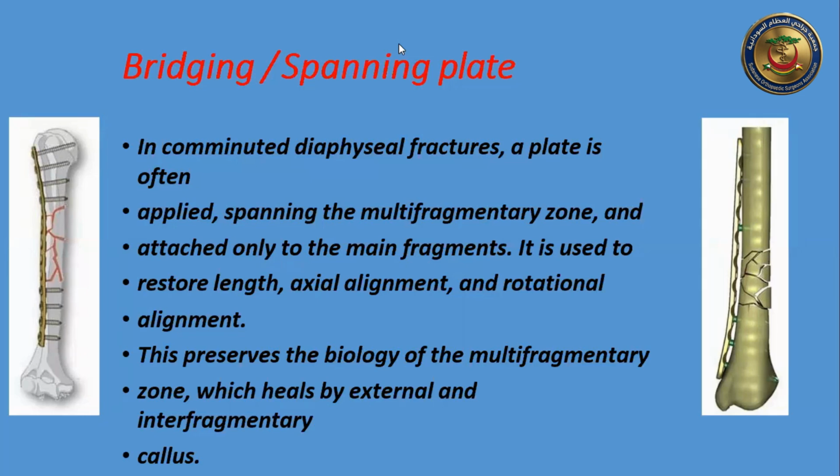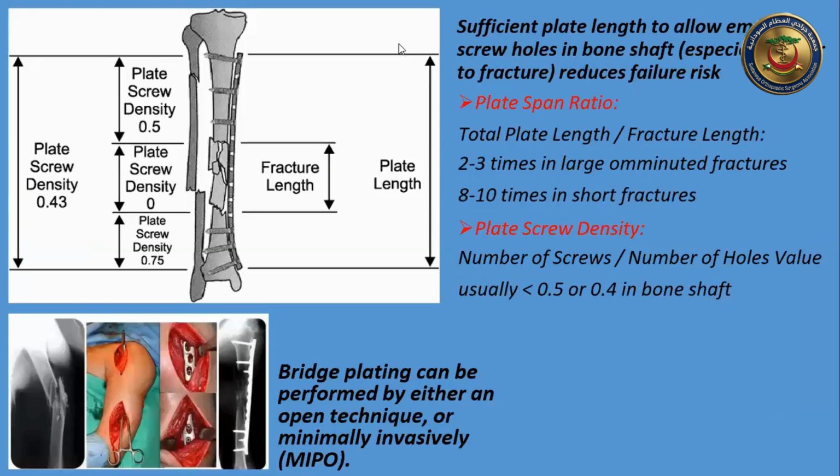We can do it in open technique, but then we lose the preservation of the biology, we lose the benefit of it. So most of them should be done in minimally invasive technique to preserve the fracture hematoma, to prevent detachment of the fragments from the soft tissue, and distortion of the blood supply, which increases non-union. This area is healed by secondary intention or by callus formation, with no interfragmentary compression, and the strain is distributed throughout the fragmented area. These are the principles of bridging plates.